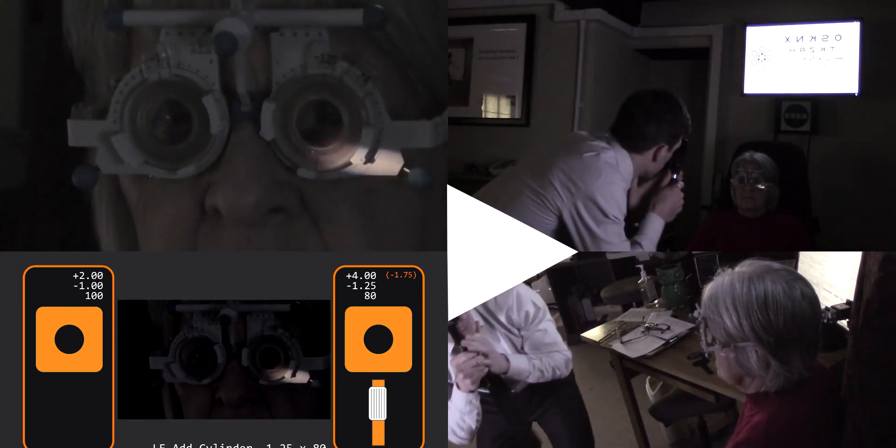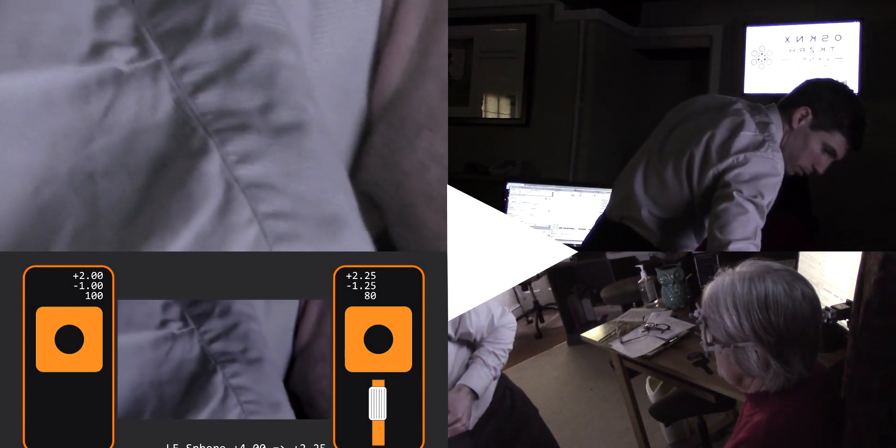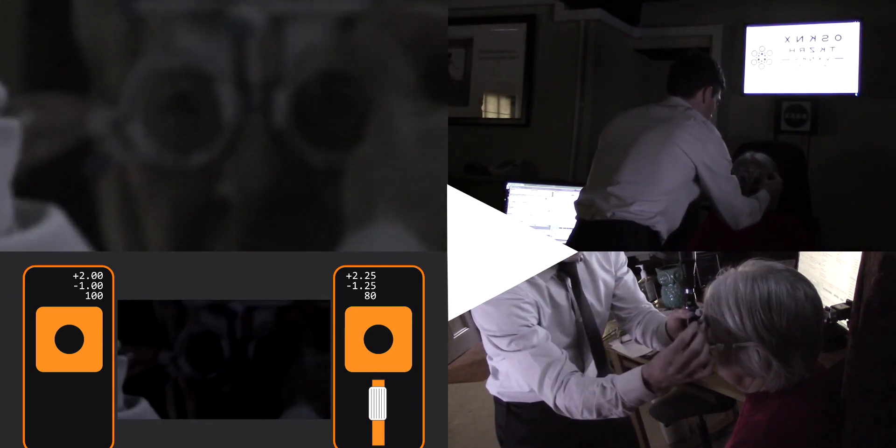A quick check of the notes to see what axis and cylinder power it was last time. It's very close to neutral in both meridians — close enough to get on with the refraction. He decides nothing is to be gained by spending more time on the retinoscopy. Notice how he took a little bit more off for working distance — a plus 1.75 in this case rather than his usual plus 1.50 — because of the slight with movement he saw in both meridians when he had finished. No doubt he's taken about a minute and a half to do both eyes, and he now knows what type of refraction it's going to be from the quality of the reflex.